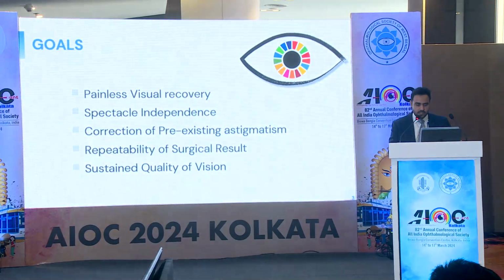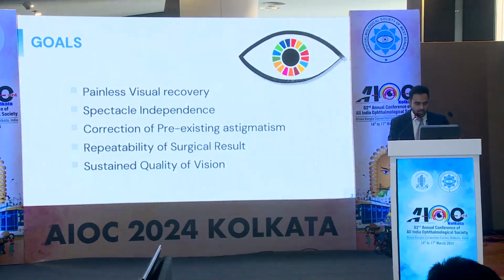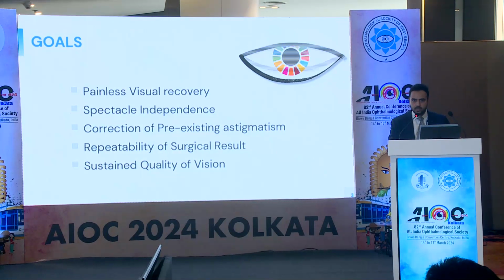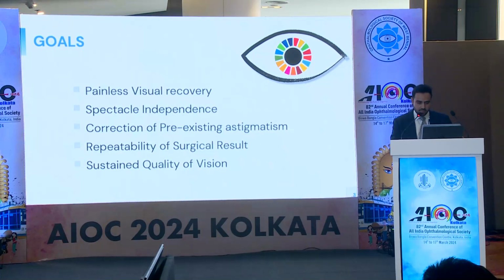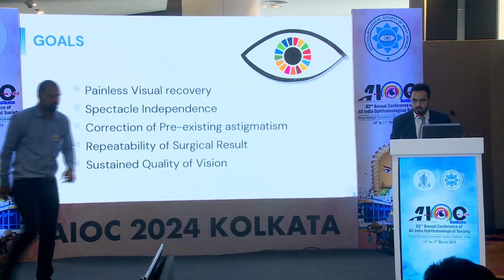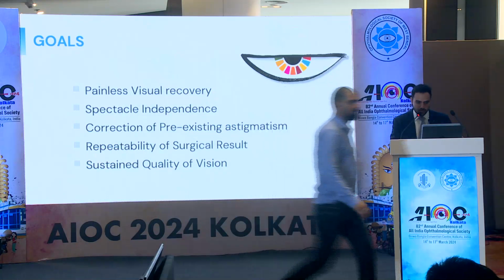So what are the goals of the surgery? Mainly it is painless visual recovery, spectacle independence. We have to correct all the pre-existing astigmatism, repeatability of the surgical result, the surgeries that we are doing, and give a sustained quality of vision to the patient.